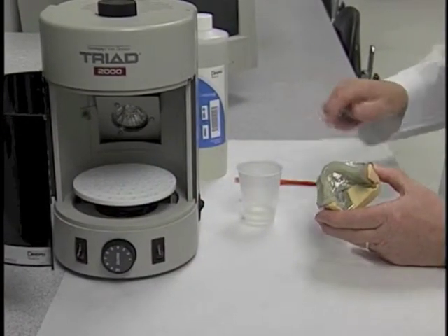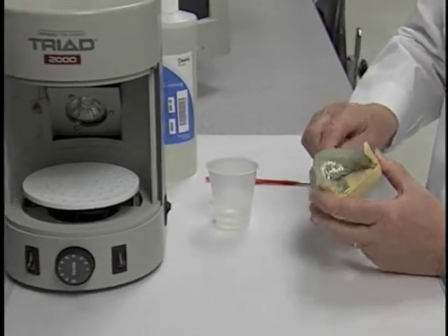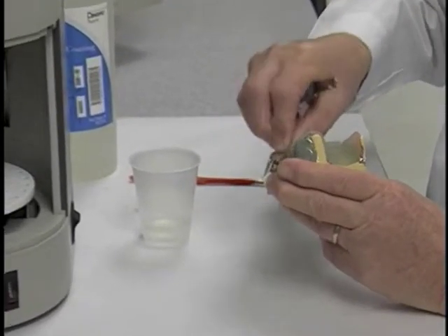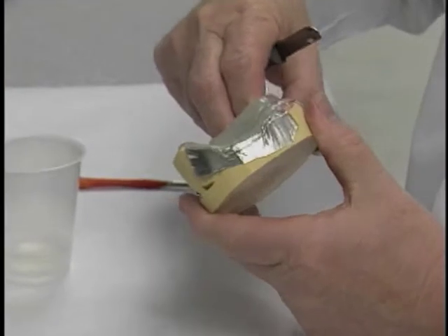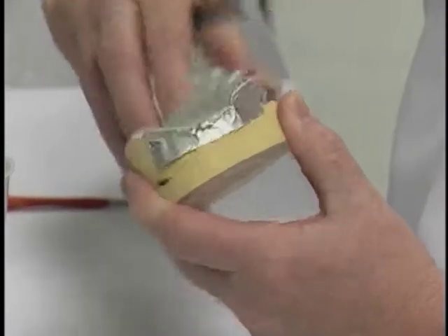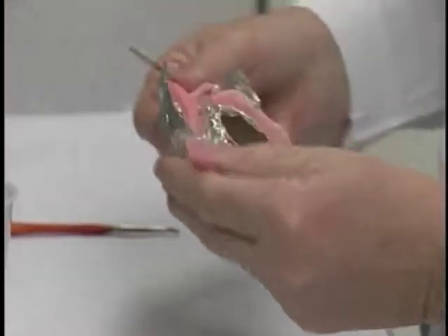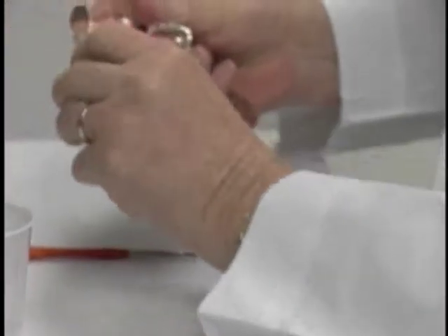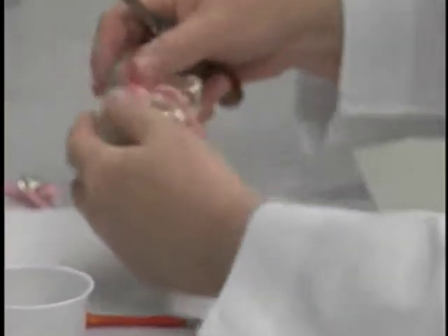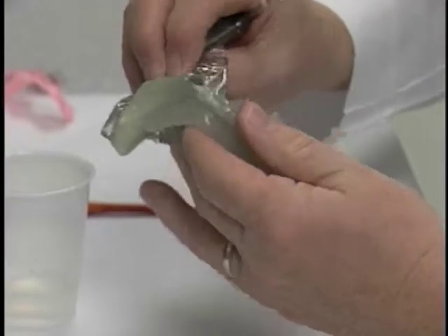From the unit, take the tray off of the cast. Remove everything from the inside of the tray, any wax that we have, and tinfoil from the inside of the tray.